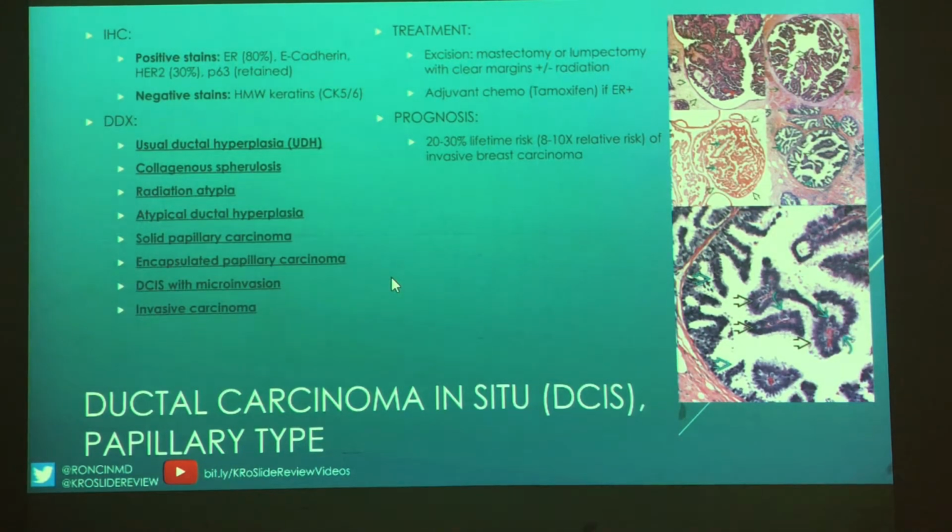All this is exactly the same information that we had on that DCIS slide, just more examples of papillary architecture. You can see that picture is especially lovely. It has both papillary and micropapillary. The micropapillary is more towards the actual edge of the lesion, whereas the papillary is all in the center.